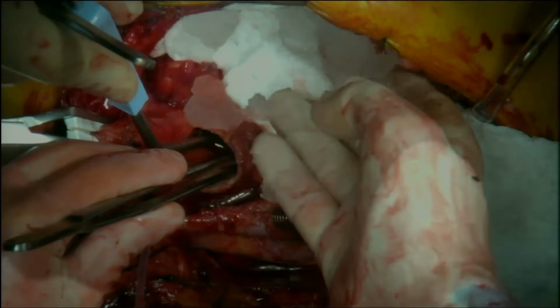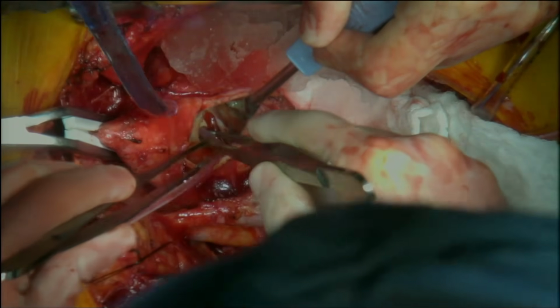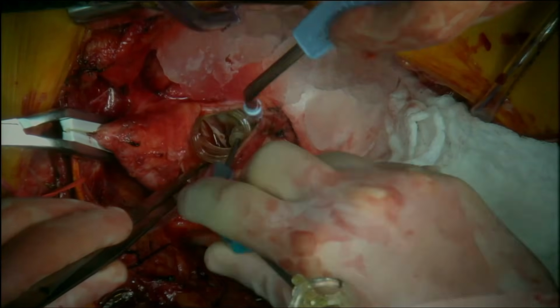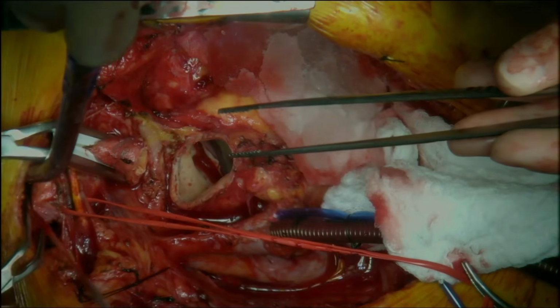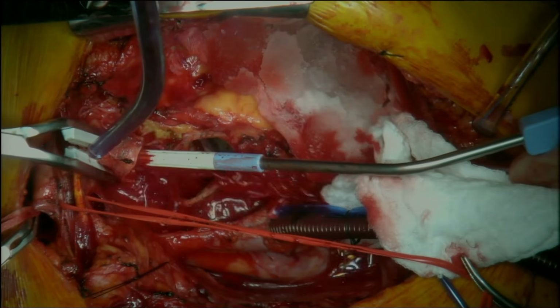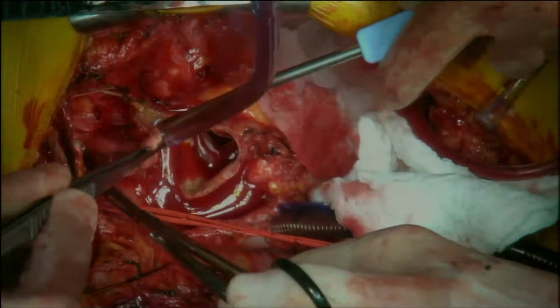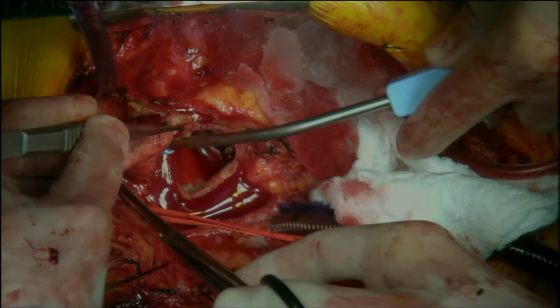Cooling is continued to the target temperature, and cardioplegia is delivered directly into the coronary ostia for myocardial protection. Sizing of the aortic valve is performed. The innominate artery is clamped in preparation for circulatory arrest. Systemic circulation is arrested to permit safe arch reconstruction.